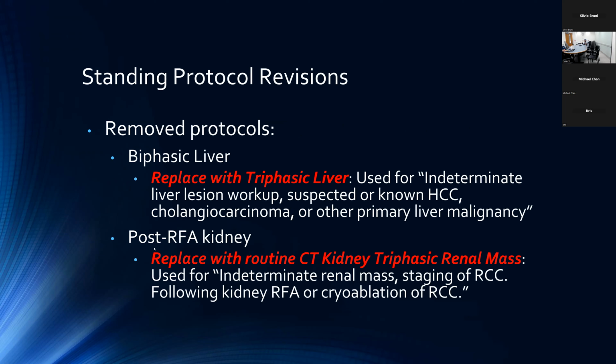So to start off, for the sake of simplicity, we've decided to remove some of our protocols that were a bit redundant or being used incorrectly. So this includes the biphasic liver CT. Unfortunately, as it presently stands, this protocol is still available for RADs to select. So although they will be reminded that this protocol is no longer actionable going forward, until we're able to entirely remove the protocol from Epic, you may still rarely encounter it being selected. For the most part, you shouldn't encounter it very often.